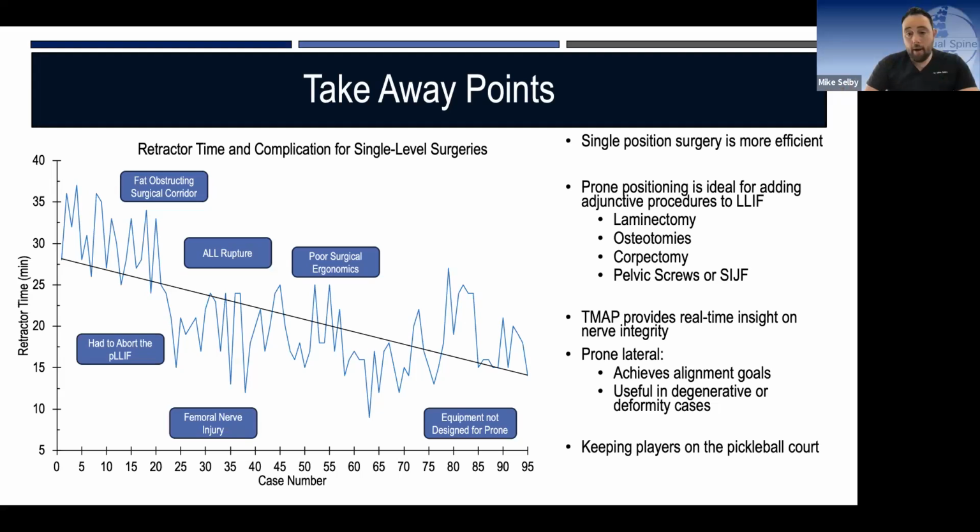I think the good thing about prone lateral, though, is that you've usually got your screws in the back or you're ready to do them. This can happen with a regular lateral sometimes to people as well. And unless you've got an anchor ready to go, like a combined integrated cage, it's almost impossible to hold it in there. And so, having the posterior screws in and ready to drop rod, you can come back at a later date and do something else if you have to as well. You can give stability from the back temporarily. So that's a good thing about the prone technique in some ways.